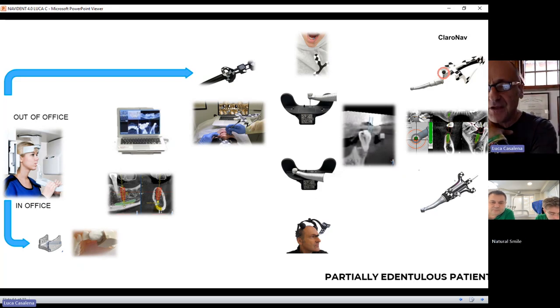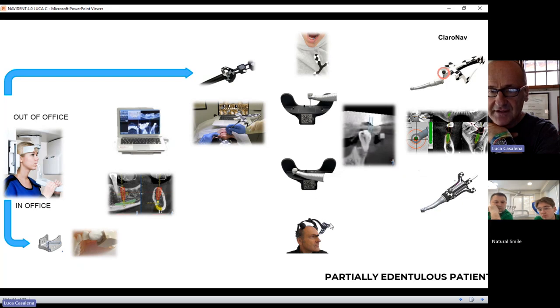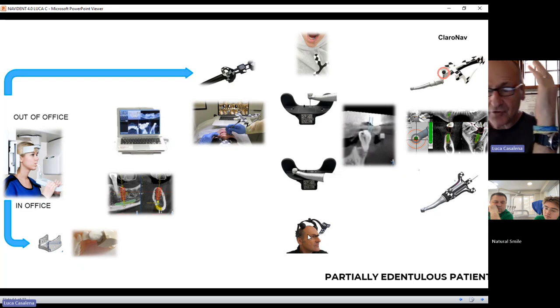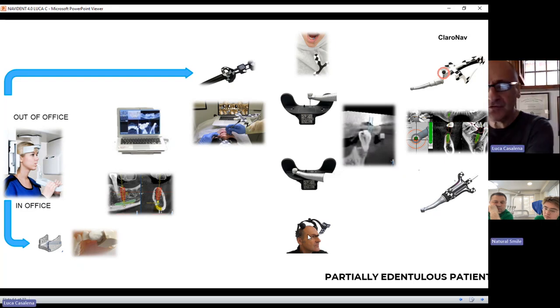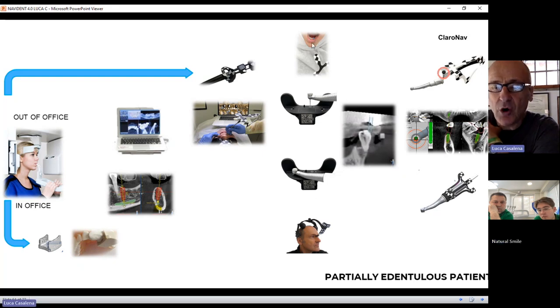For the patient — for the upper jaw — we have a head track, something you position on the nose and behind the ears, to let the software track the patient's movement. We put this on the forehead because the upper jaw is attached to the skull — by moving the skull, you move the upper jaw. But the mandible is free and loose, so you need an optical target specific for the mandible.